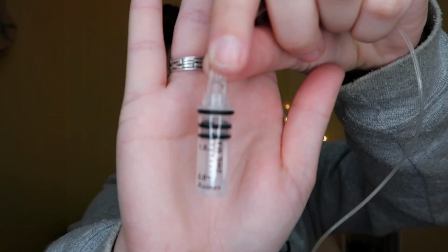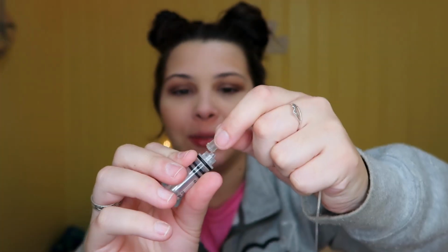I really don't know why I still have a tube in here and a cartridge. But this is what the cartridges looked like on this pump. Because I think all pumps look different, so I think it's kind of cool to see what everything looks like.